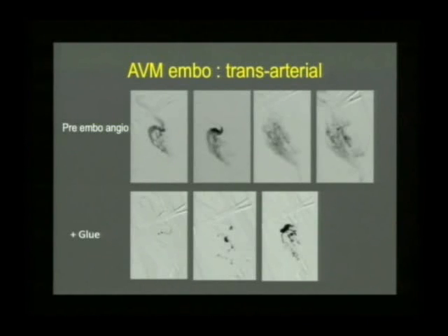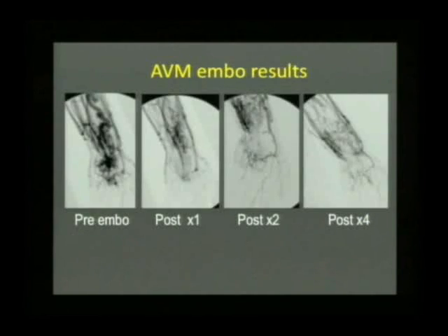Transarterially, sometimes it's more difficult, and if I'm really not out far enough, I'm very concerned about injecting alcohol transarterially, and sometimes I'll inject glue, and here is some glue being deposited. It doesn't look very good, and I've shown you this because we've got a build-up of glue too proximally, and we've not got good diffusion of the glue through the entire nidus, but this did help because we used a combination of transarterial glue and percutaneous alcohol injections, and this is what one patient has looked like.